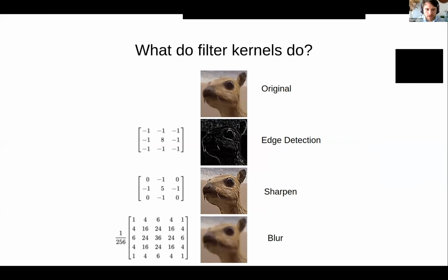If you've never worked with a kernel, it might seem like, what on earth are these things? But if you were to take this original image here and convolve it with this kernel, a bunch of -1s with an 8 in the middle, it acts as an edge detector. This kernel is able to pull out a feature from the original image just based off the structure of the kernel. Kernels can be used to enhance an image, blur an image, or extract features from an image.